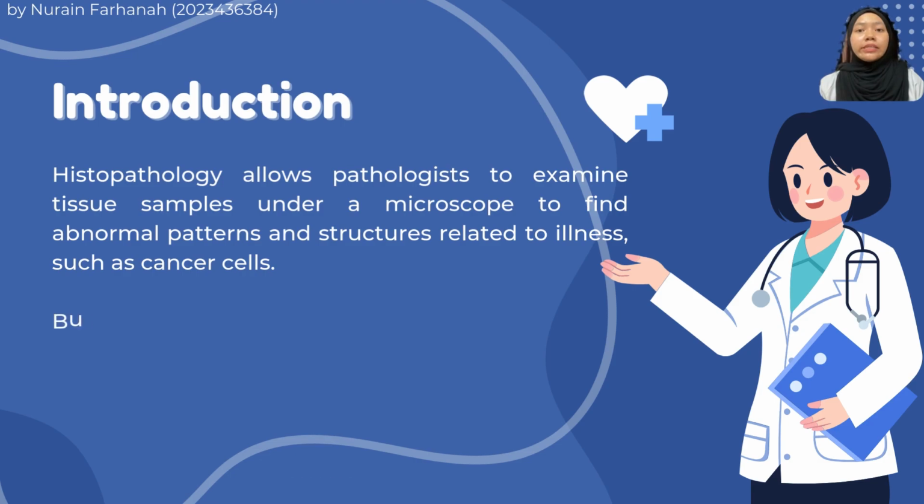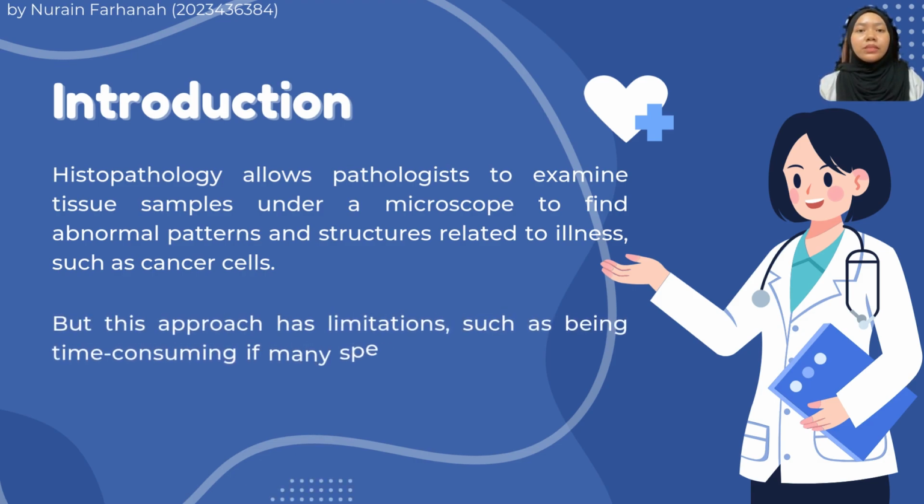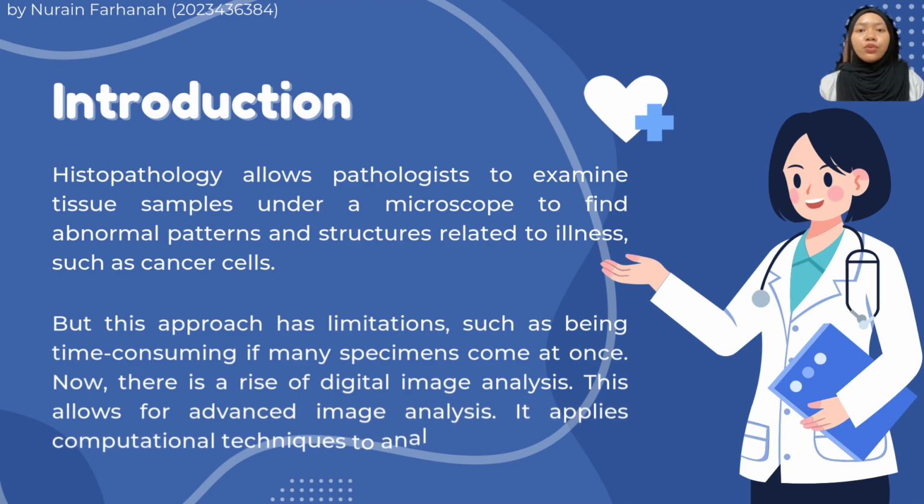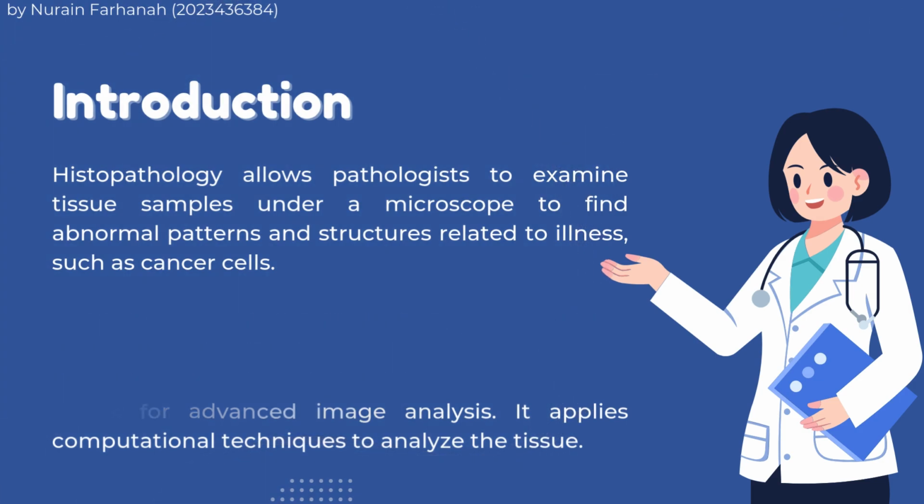But this approach has its own limitations, such as being time-consuming if many specimens come at once, human error, and its magnification. Now, there is a rise of digital image analysis. This will help reduce human error because it uses computational techniques to analyze the tissue.